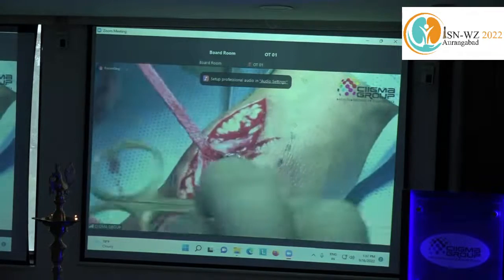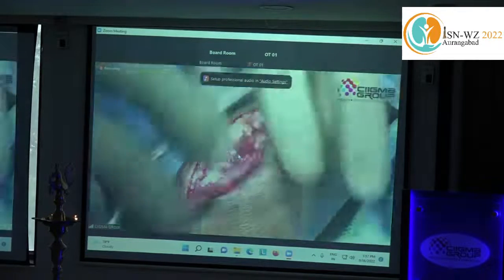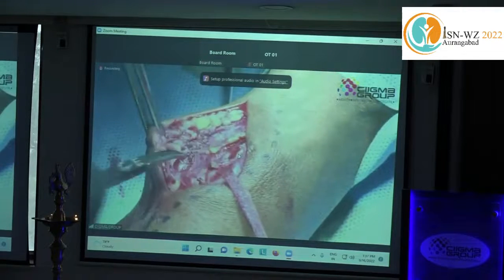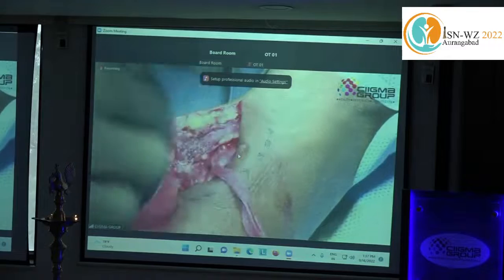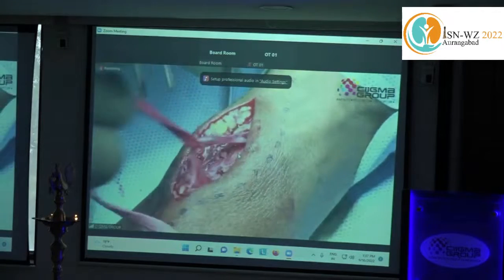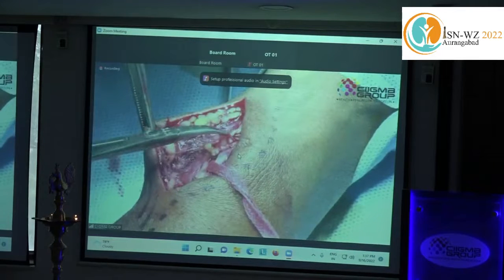Okay, so fair enough. We put 2 clips on this small tributary. Now we are almost done with the cephalic vein, right? So I will proceed with the radial artery now. Always make sure not to dissect the subcutaneous vein, because as I told you, luckily we don't find that superficial branch of the radial nerve near our vein. That is good. One point to be very vigilant about.